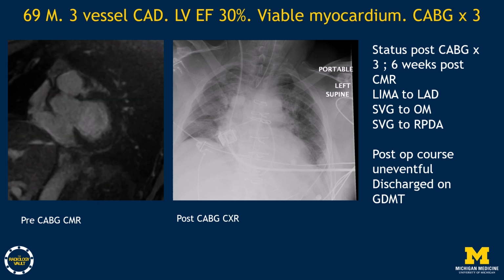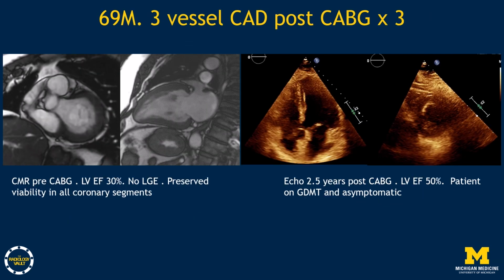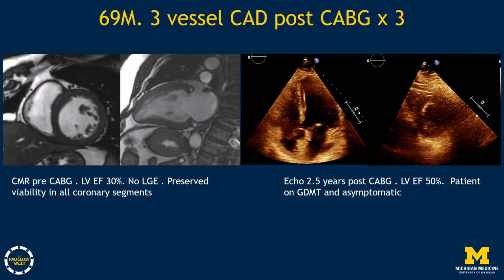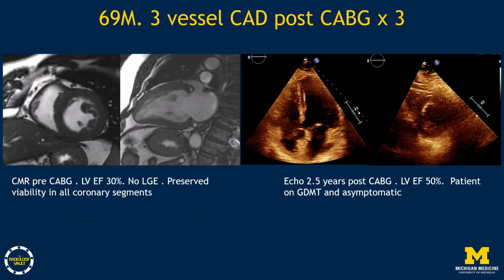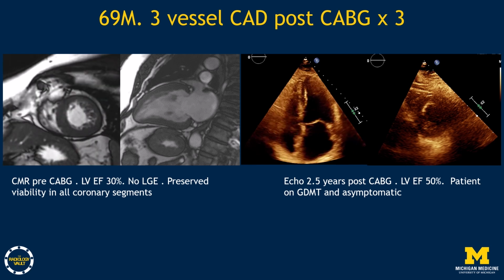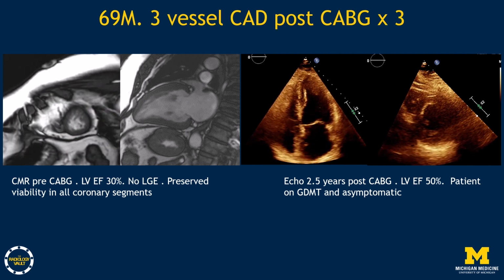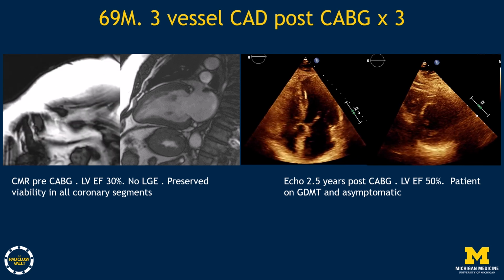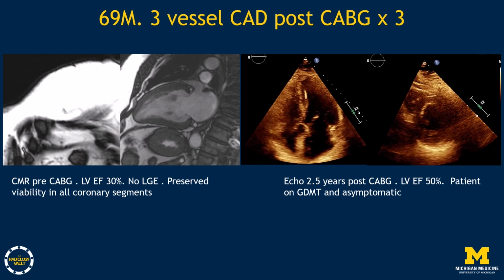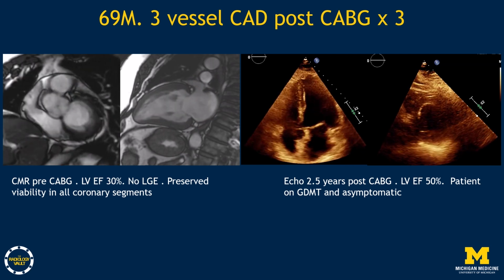His postoperative course was uneventful. He was discharged on guideline-directed medical therapy. And approximately 2.5 years after the bypass graft, the LV ejection fraction has improved to 50%, as can be seen on this echocardiogram, which is routinely performed in patients for follow-up after bypass grafting or revascularization. The patient is asymptomatic on guideline-directed therapy and is doing well clinically.